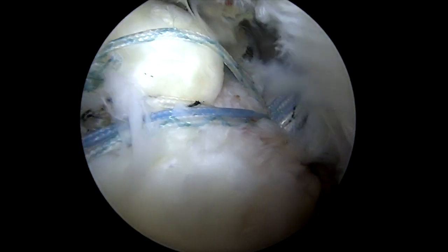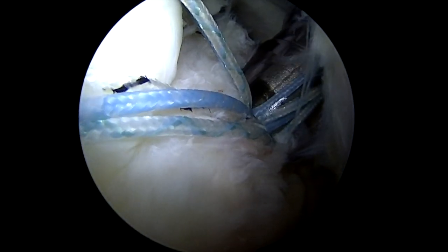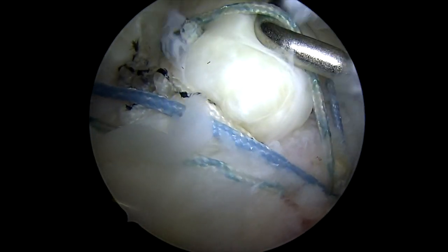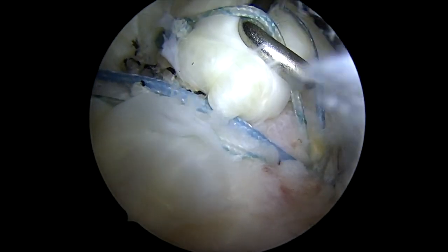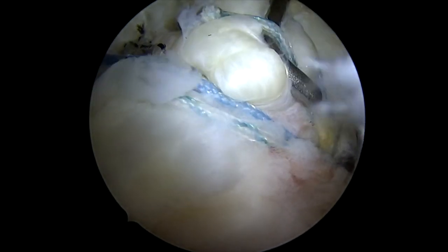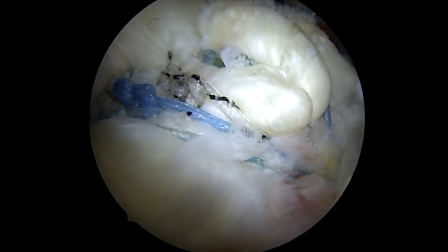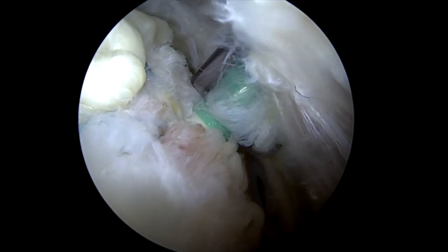So you can see here, I'm making sure I know exactly where that should go, so we'll punch a little hole in the bone there. This anchor is what's called an interference fit anchor, which means that once we screw the anchor in, the sutures will compress. Right now the anchor is not yet screwed in, and what I'm going to do is pull tension on the sutures to compress the tendon down against the bone. You can see me working with a probe here to make sure that the sutures are spaced so we can make a flat surface on the tendon and get our compression nicely distributed across the tendon. Once I've got those all pulled, I can screw in the anchor and set that tension and lock it in.